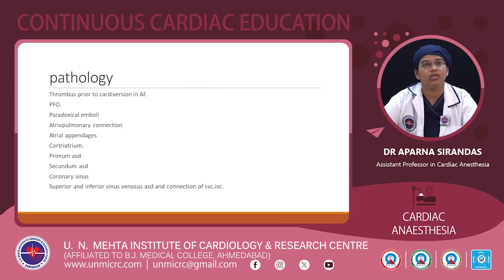Coming to the pathologies: thrombus prior to the cardioversion in atrial fibrillation, patent foramen ovale, paradoxical emboli, atriopulmonary connection, atrial appendages, cor triatriatum, and primum ASD, secundum ASD, coronary sinus ASD, superior and inferior sinus venosus ASD, and connection of SVC and IVC.